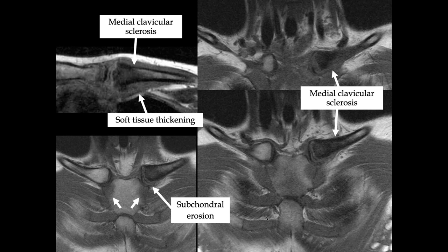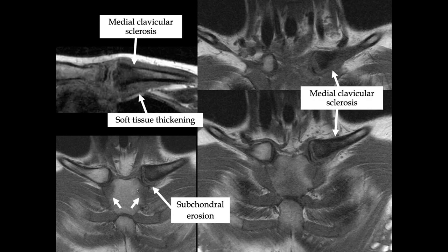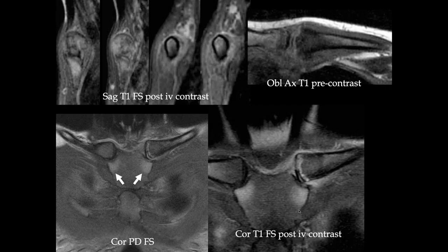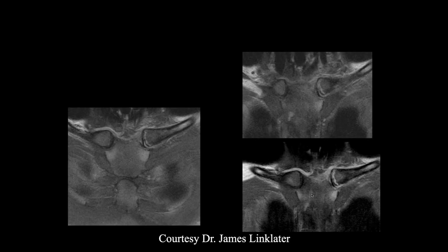We have some subchondral erosion and soft tissue thickening of the left clavicle. There's low signal throughout and some low signal within the sternum, with increased soft tissue thickening near the proximal left clavicle and some edema there. On post-contrast imaging, you see enhancement at the costochondral junctions and the sternoclavicular junction.